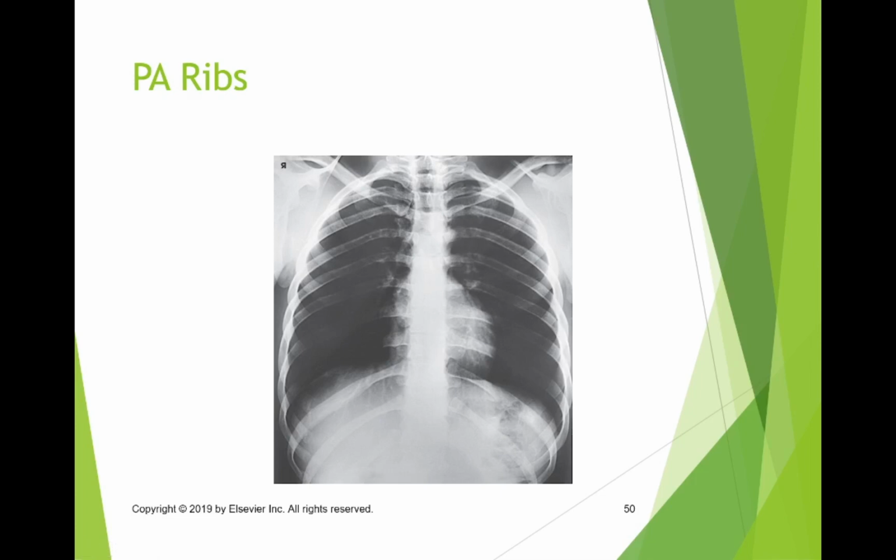With that, if you remember on the sternum breathing technique, we used maybe 3 seconds to try to blur out not just the lung markings, but the ribs themselves. Obviously, we don't want to blur the ribs out here. So we would do possibly a limited breathing technique, and what you would have there is possibly as much as a half-second exposure. What you would do is have the patient take in a big, deep breath and slowly start to exhale. And as soon as they start that exhalation, you make your exposure. That moves the lung markings enough to slightly blur them while not blurring the ribs.